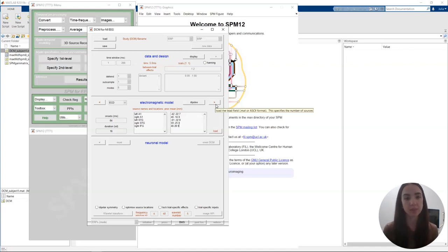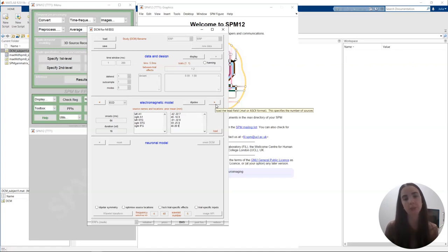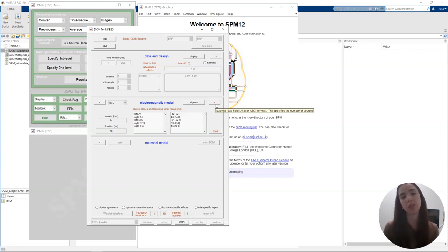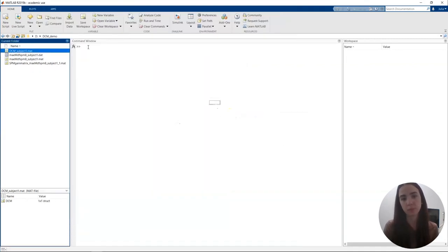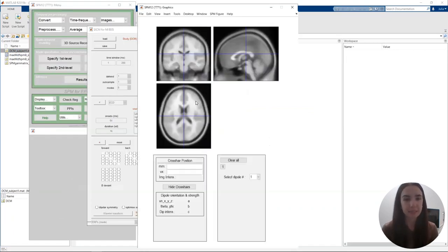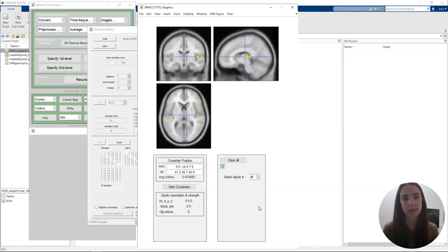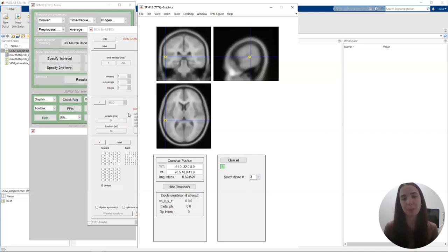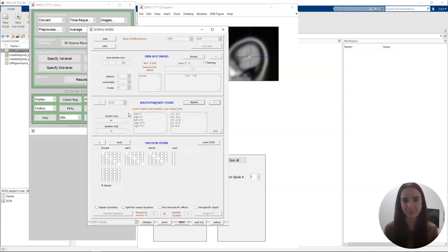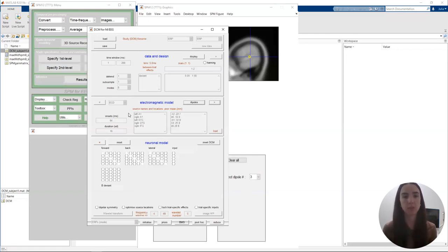Here we can also specify the onset. By default this is 64 milliseconds with a duration of 16 milliseconds — that's your stimulus onset. You might want to change it if appropriate. After clicking next, we can see all the sources we've just added. You can view them all at the same time or look at them one by one to make sure they are in the right place. Then we move on to the next section called Neuronal Model, where we'll specify the connections between these sources.